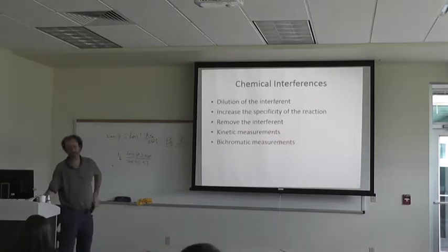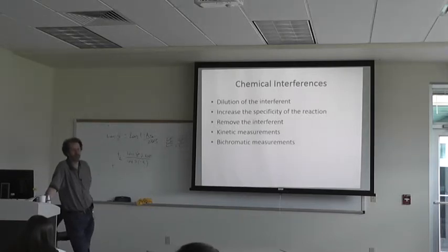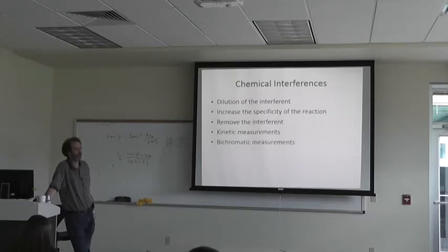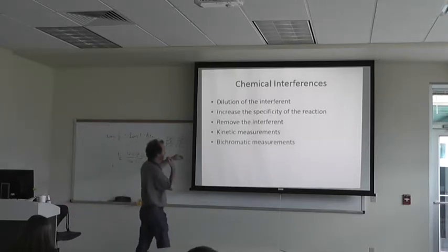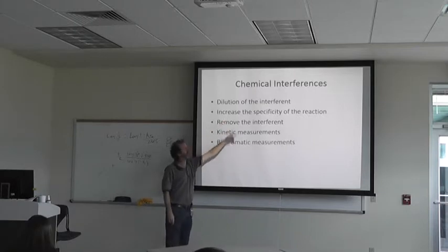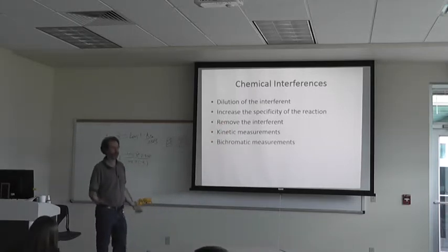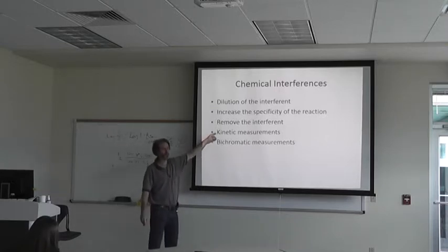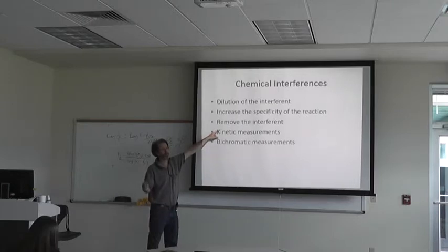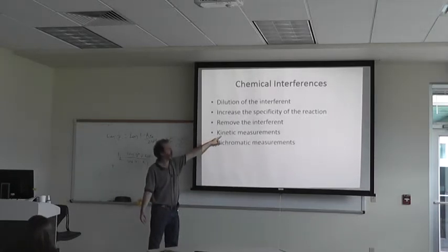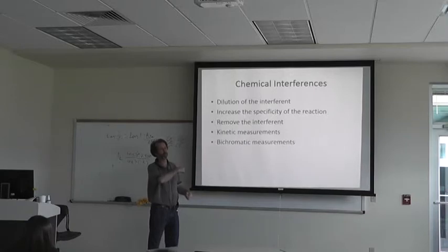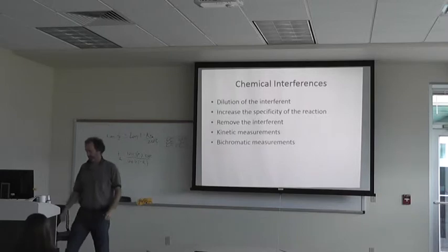Chemical interferences: you can dilute the interference, but then you're also diluting your sample and the analyte you're interested in, so you might lose sensitivity. You can increase the specificity of the reaction by switching to better antibodies, a better column, or better stationary phase. You can remove the interference via extractions. Or you can do kinetic measurements or bichromatic measurements rather than single time-point measurements.